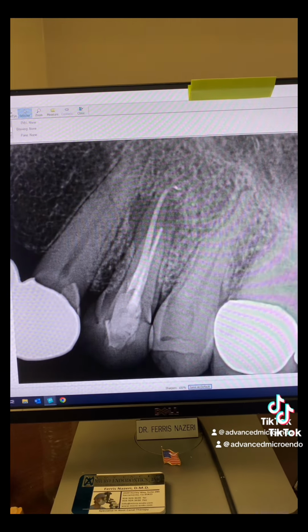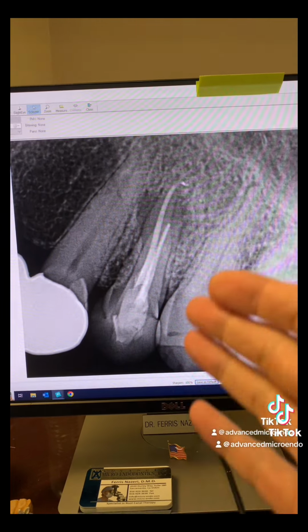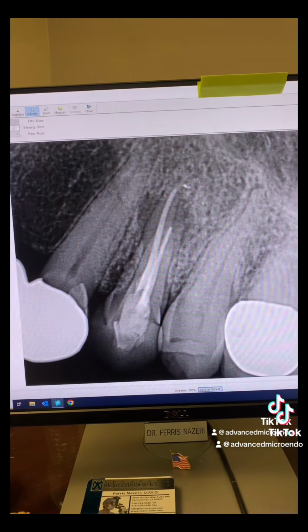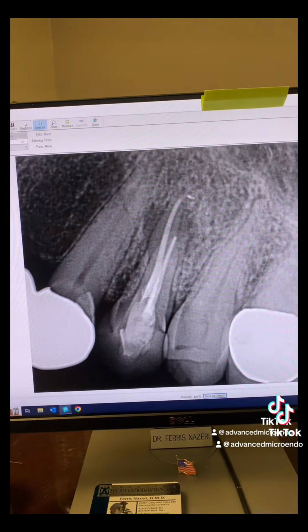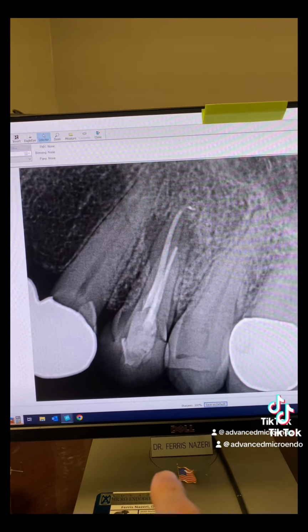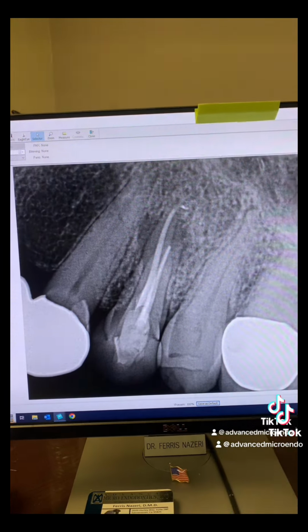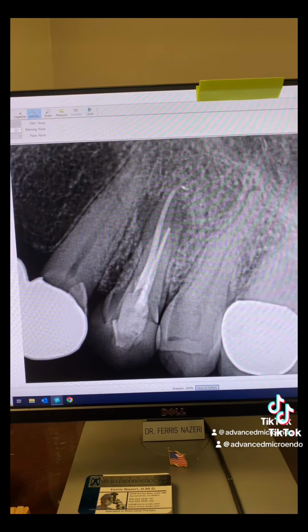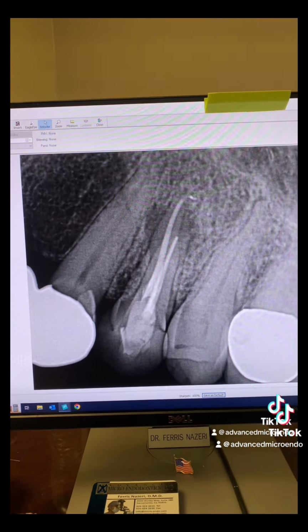We save this patient lots of money and pain and suffering. This patient, if we misdiagnosed and recommended redoing the root canal here, the patient would have paid for redoing the root canal. The patient would have likely had to pay me to redo the root canal, pay the dentist to get a new build-up and crown, and of course the root canal retreatment. The retreatment would have failed because we had misdiagnosed. But right now, just now, we saved this patient tons of money.